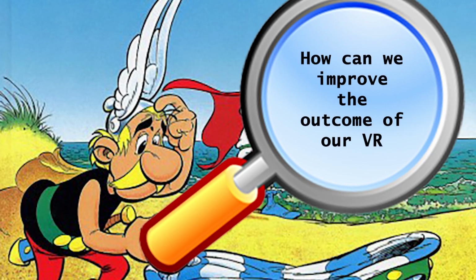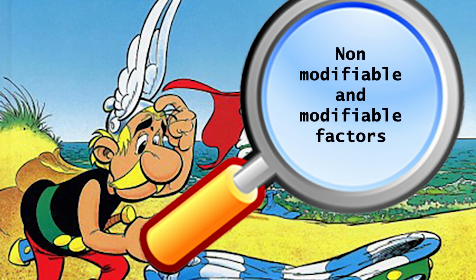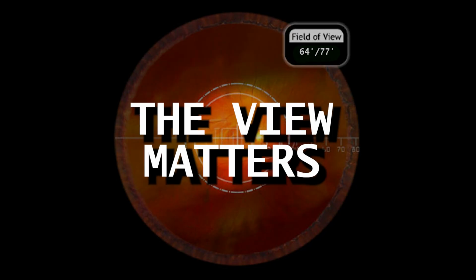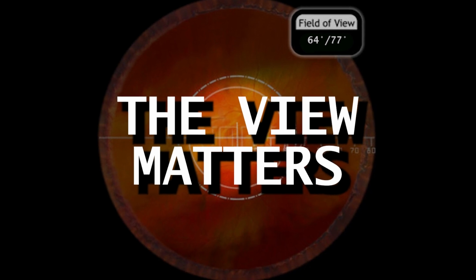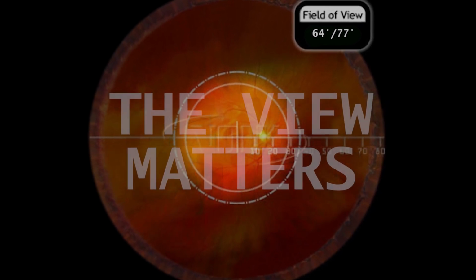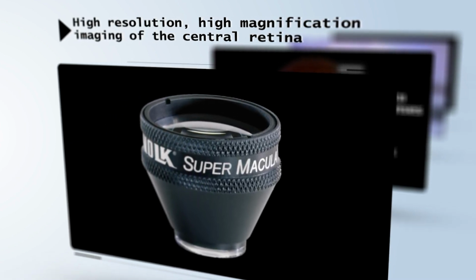How can we improve the outcome of VR surgery? Non-modifiable factors for the surgeon is the surgery itself, but the modifiable factor is the view. Best of the best surgeons with favorable patient factors suffers in the hands of poor visualization. In this video, we highlight the importance of a magnified view with higher resolution.